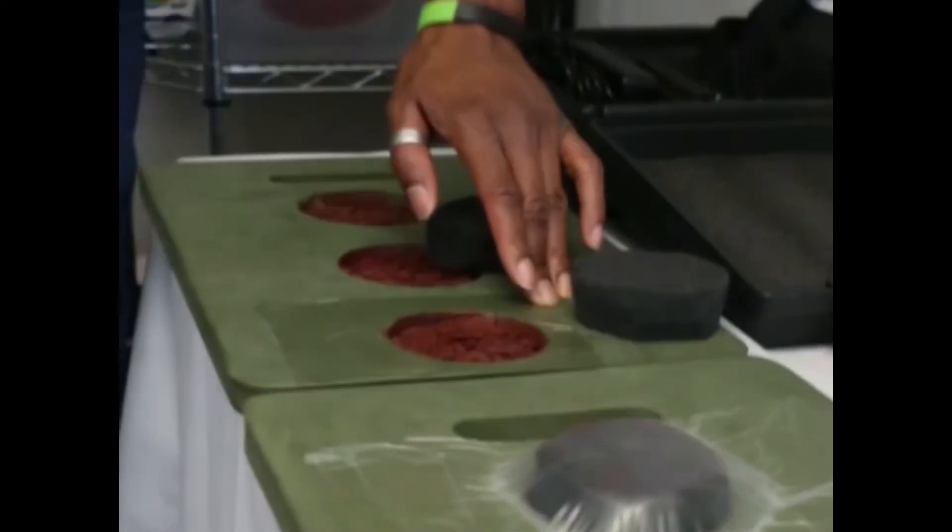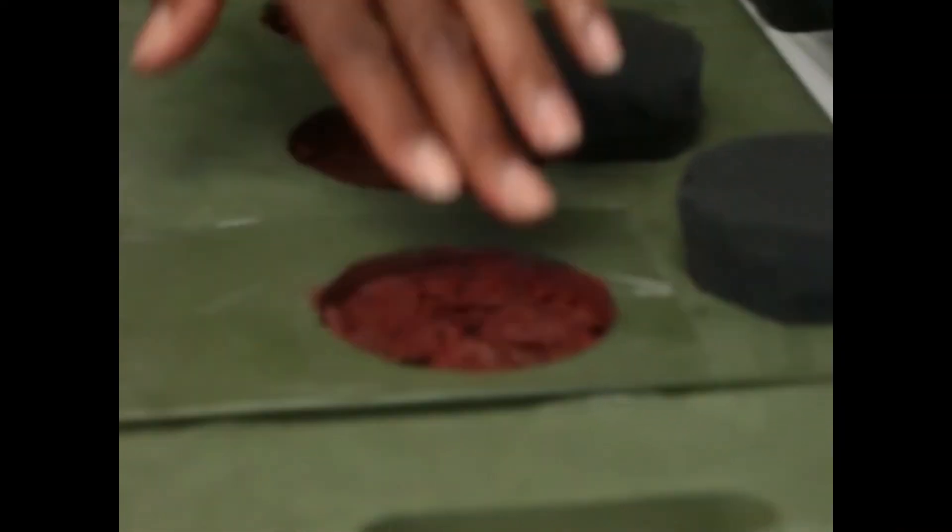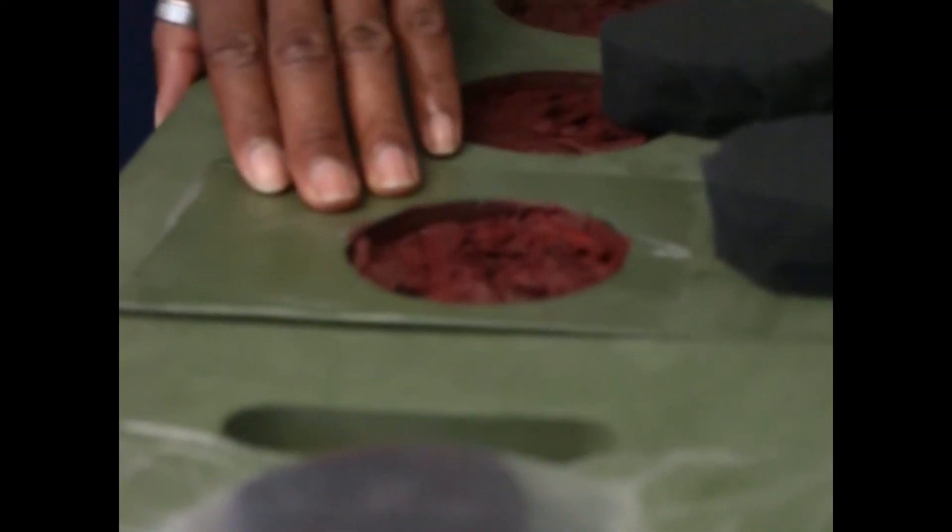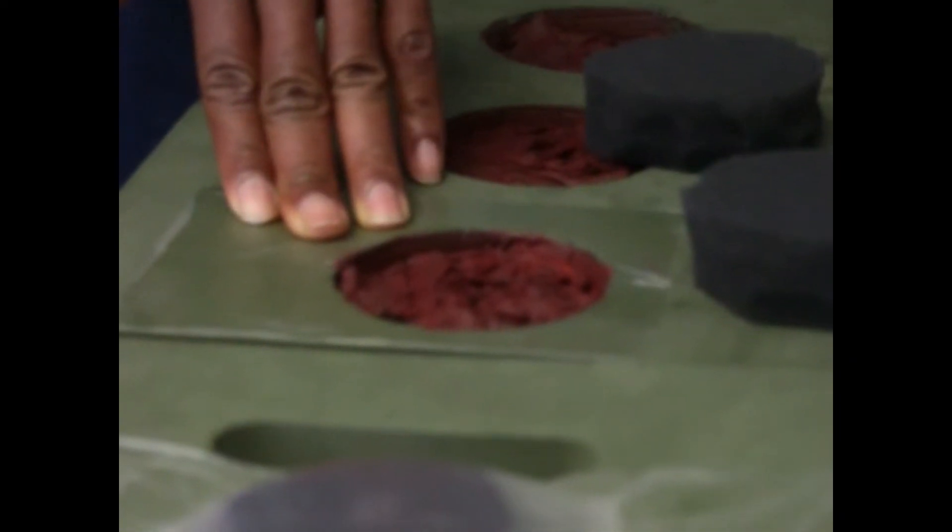To protect your peri-wound skin, you can use some kind of cleansing agent. What's a common cleansing agent that you could use to cleanse the peri-wound skin? Normal saline. Okay. That would work. Do you guys want normal saline? We have normal saline. Or you can use, after you clean it, you can use skin prep. Okay, that's worth it, yeah.